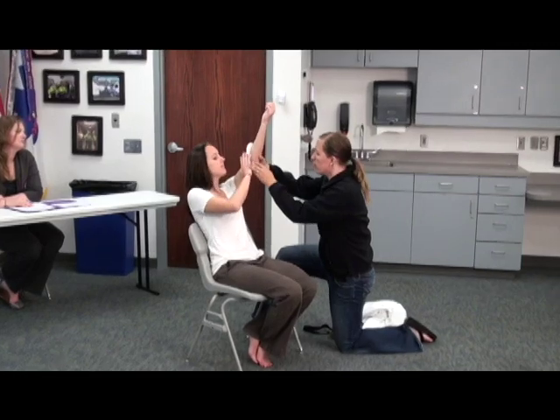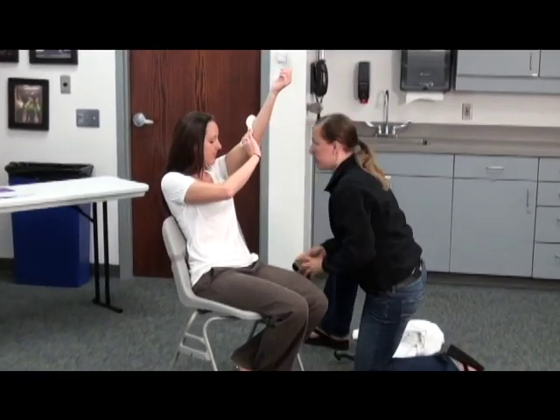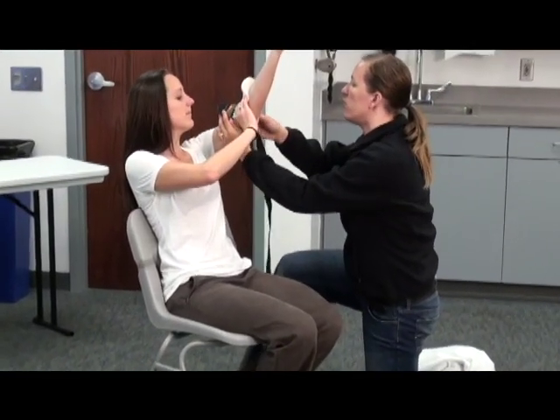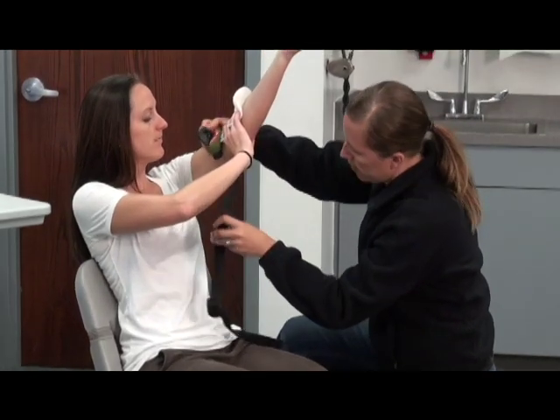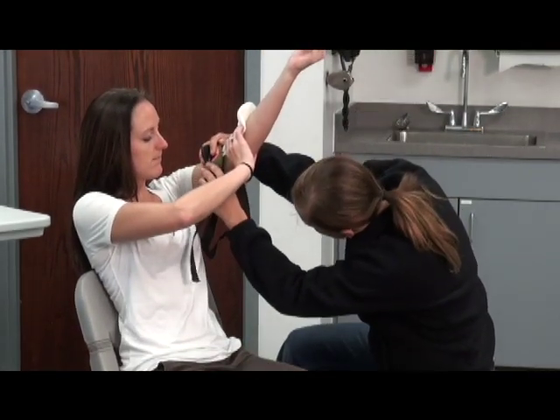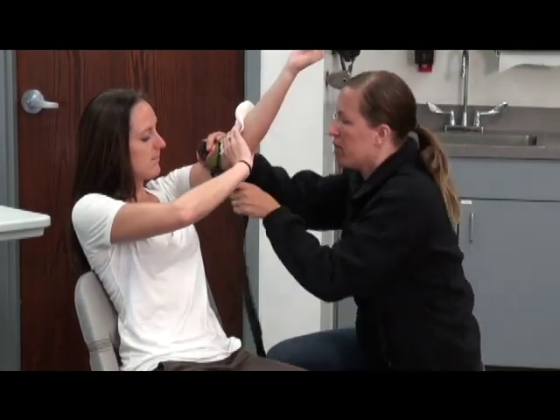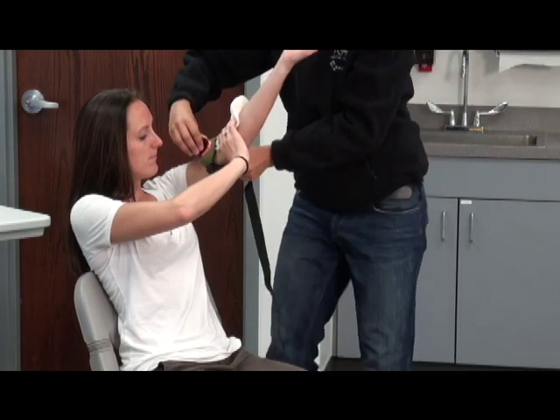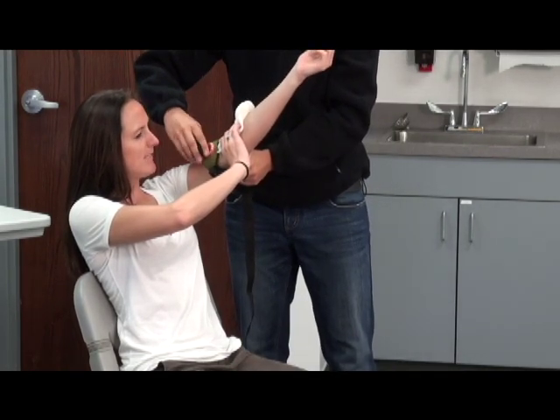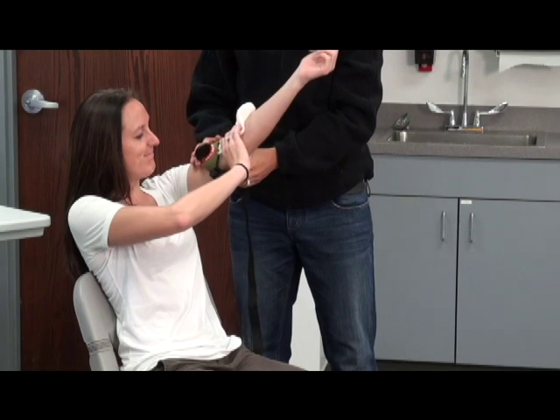Ma'am, can you put your hand here and hold this? I'm going to get the tourniquet and apply it as close to the wound as I can. Bleeding has been controlled.